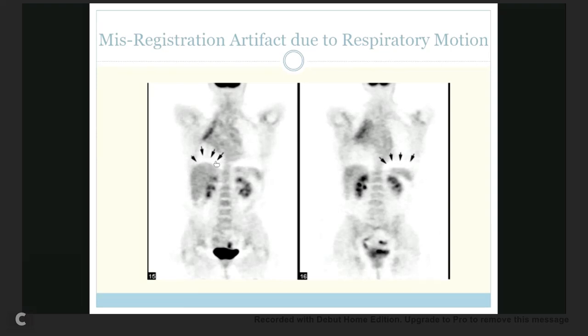Lungs, or I should say, what happened here? Inhalation or exhalation? When you breathe in, what happens? Your lungs expand, right? And your diaphragms are pushed down, and everything's pushed down, right? Is that correct? Yes. So that looks like it's higher than it was.